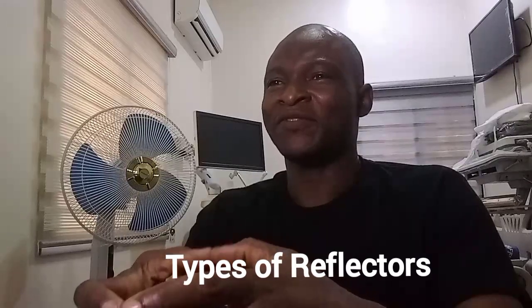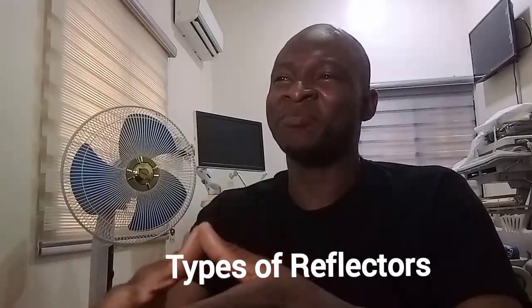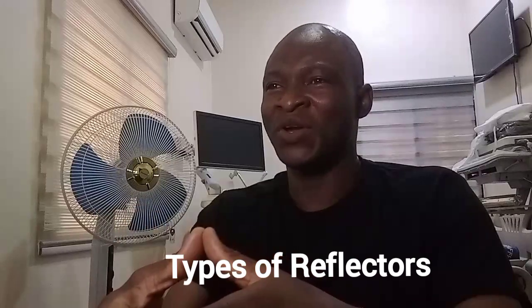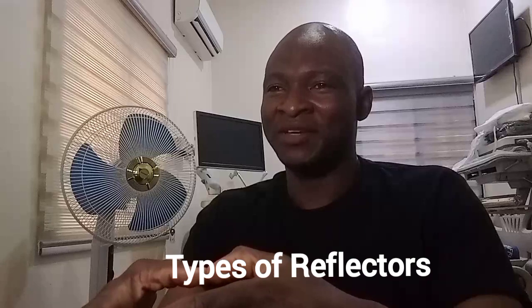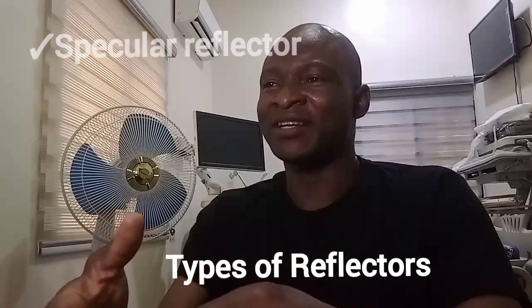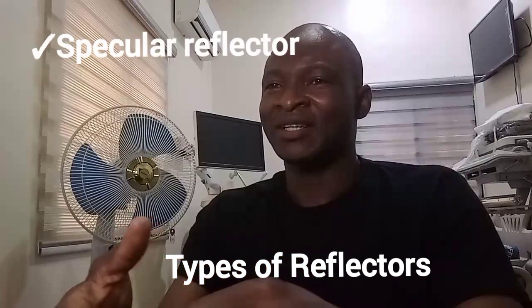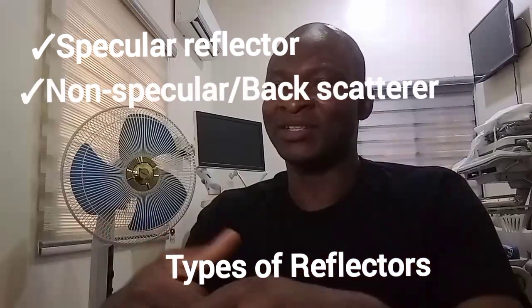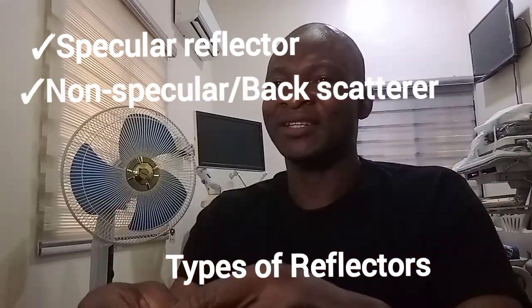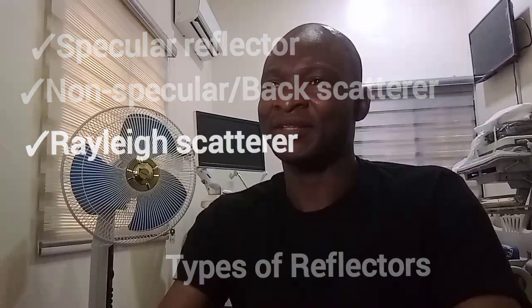There are types of reflectors, and reflectors can be classified based on the size of the reflector relative to the wavelength of the sound wave. There is the specular reflector, there is the non-specular reflector, or what you call backscatterer, and there is the Rayleigh scatterer. Let's take the first one, specular reflections.